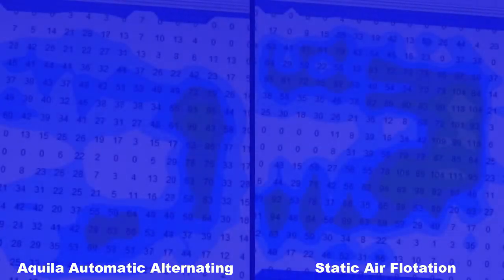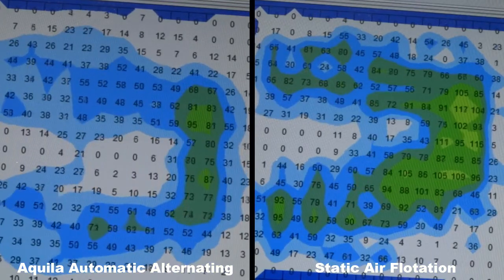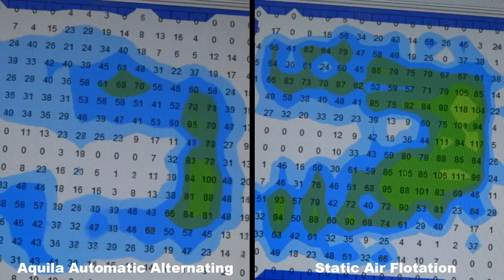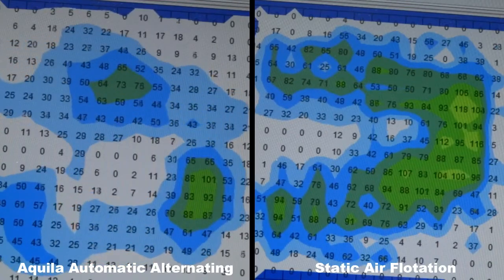Today we are demonstrating pressure mapping of a test subject sitting on two different wheelchair cushions. One is a dynamic cushion and the other is a static cushion. Pressure mapping shows the interface pressure between the person and the cushioned surface.